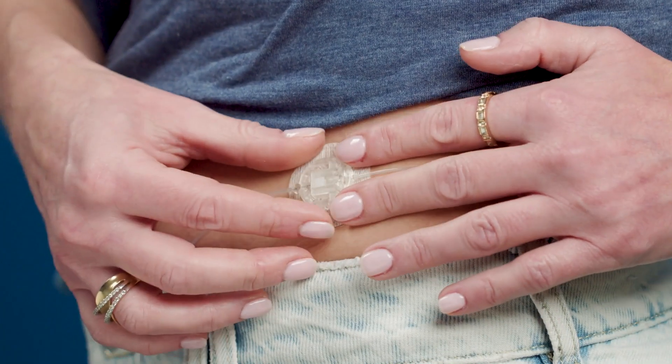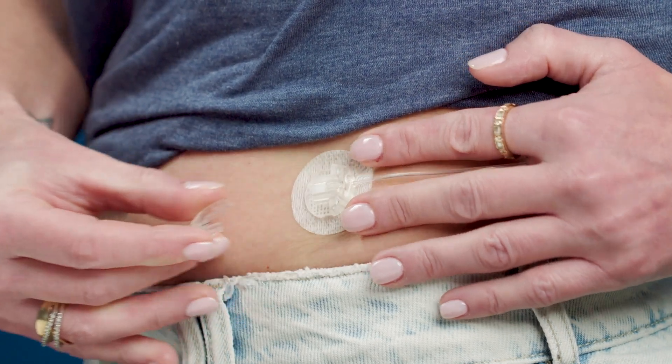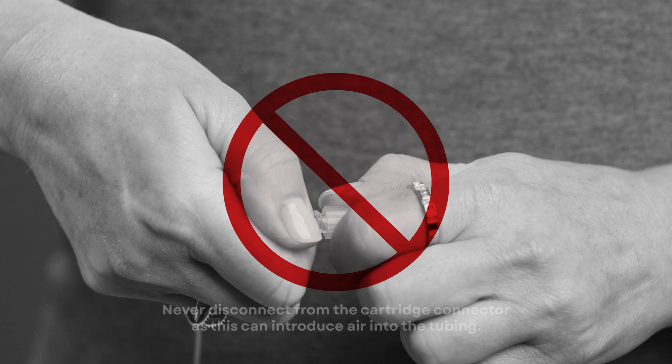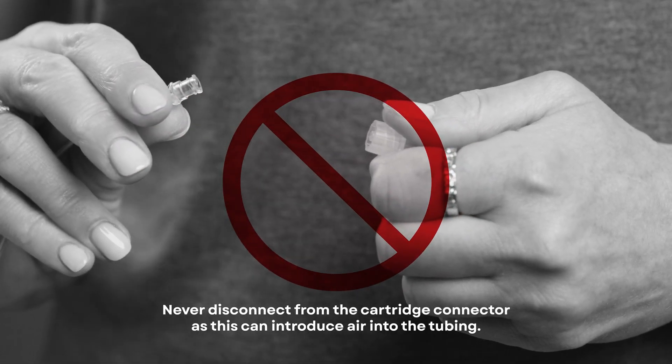Now that you've learned how to insert your TruSteel infusion set, let's talk about how easy it is to temporarily disconnect. To disconnect, place a finger to hold the infusion set stable. Gently squeeze the ridges on the area closest to the tubing while pulling straight out. Remember, never disconnect from the cartridge connector as this can introduce air into the tubing.